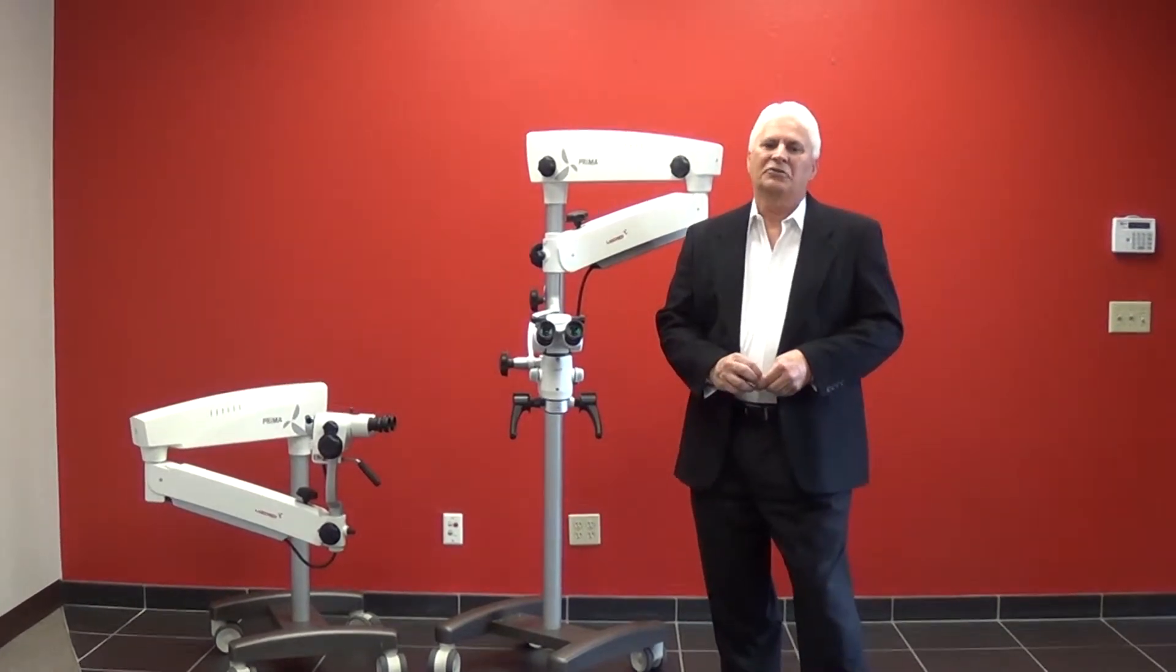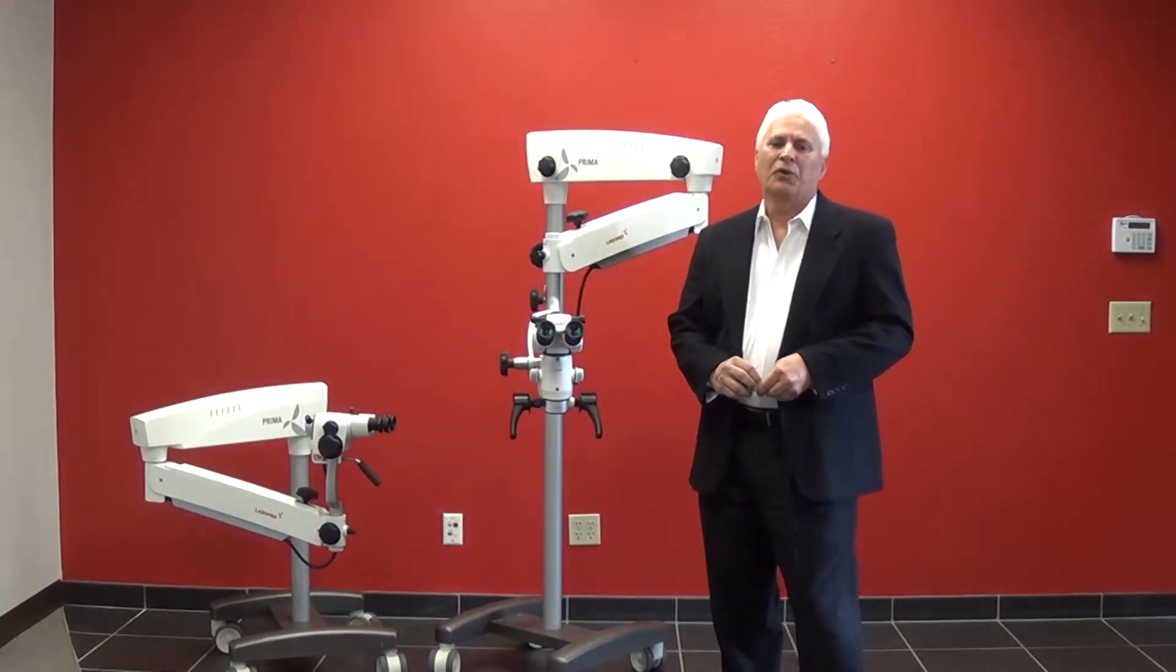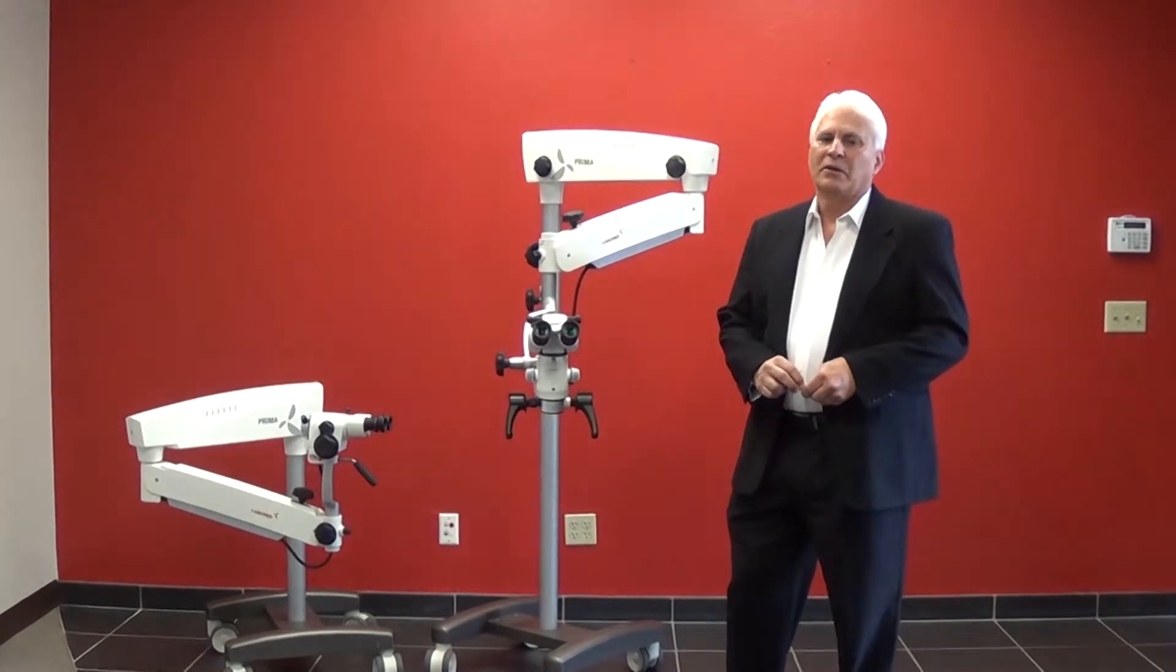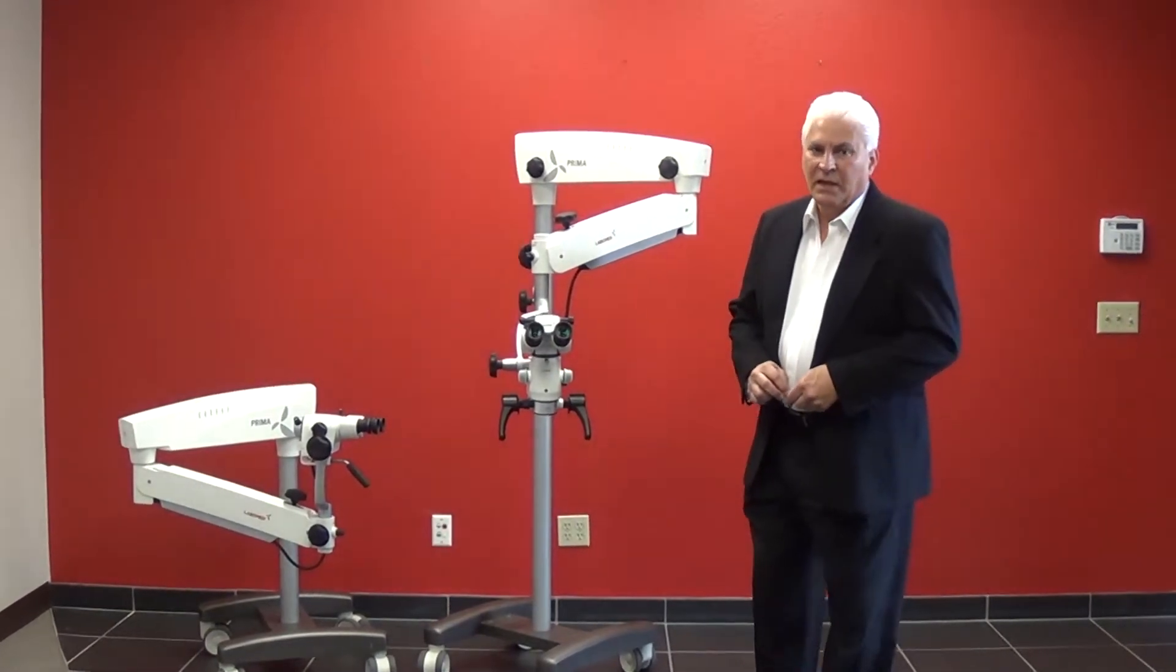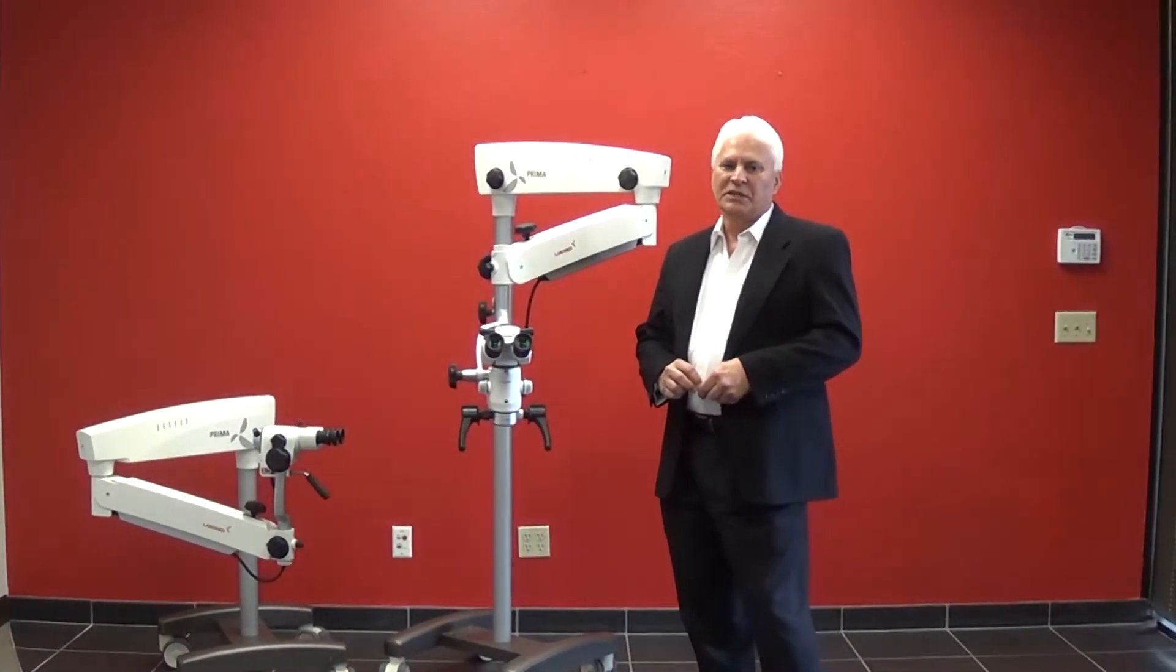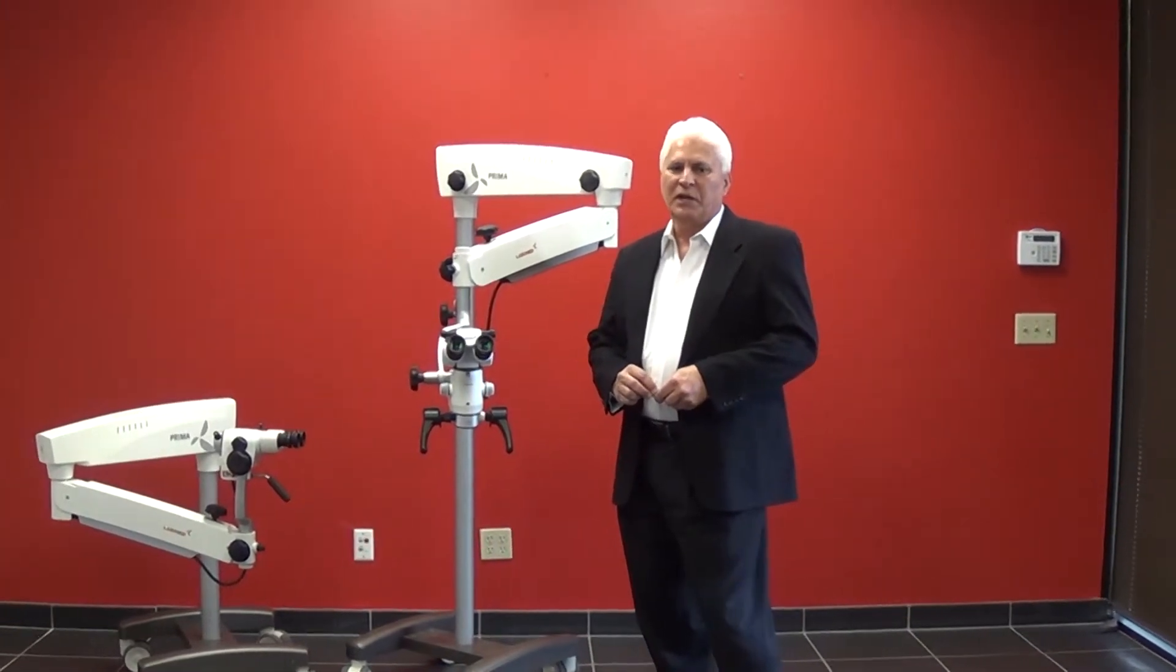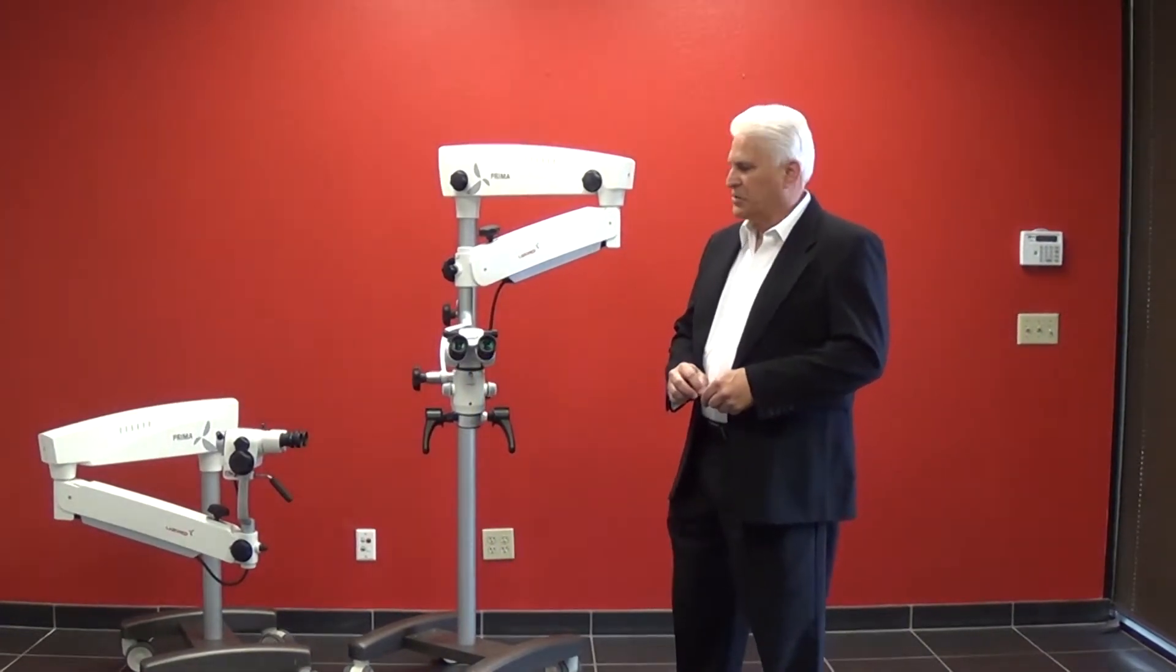In ENT, doctors must examine patients in an upright, supine, or angled seated position. Hence the microscope is positioned at various angles, which calls for a straight viewing head in line with the microscope.